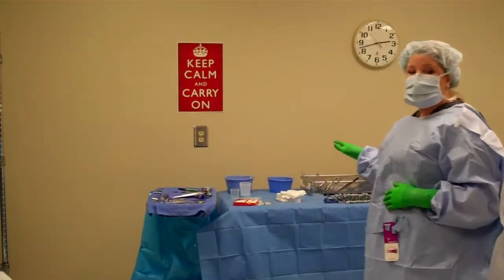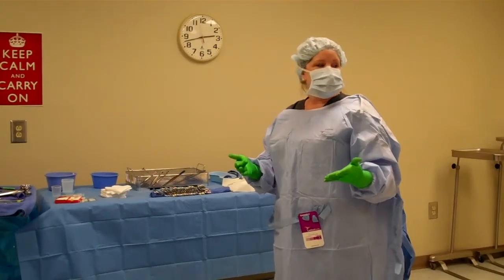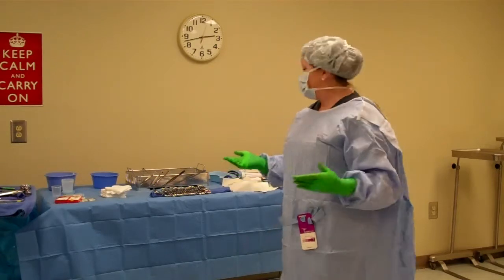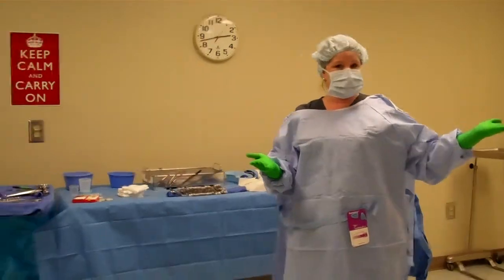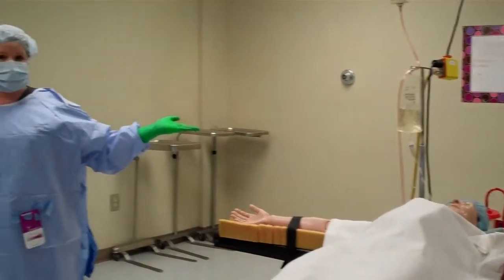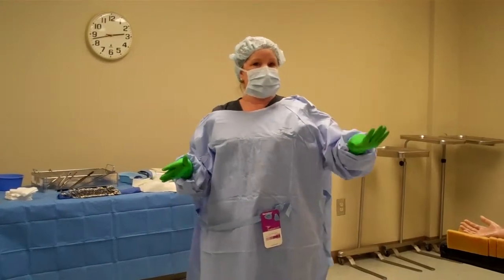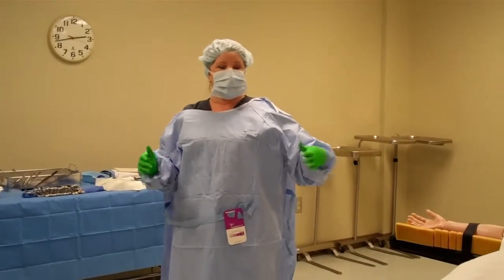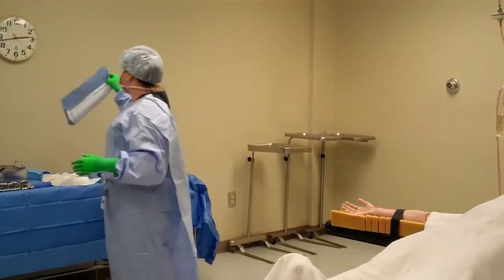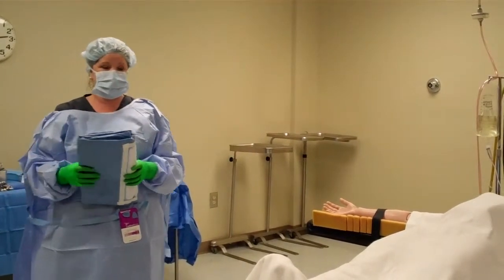Both of these, or all three of these, I will be moving over to the patient once my patient is asleep, intubated, and I have draped the patient. Right now, like I said, you're going to be up at the head of the patient, helping put them to sleep. Okay? My nurse, my circulator, will have already prepped the patient. So now it's time for me to drape. So right now you can touch the patient until it's time for me to drape. I'm going to drape.